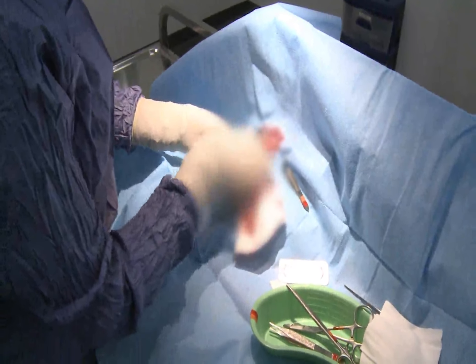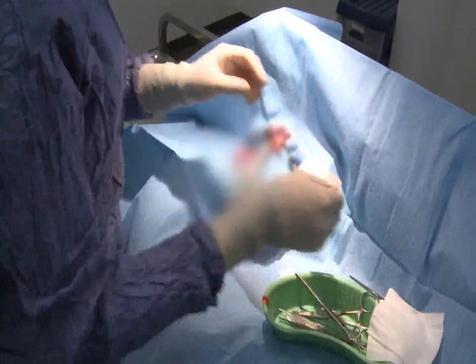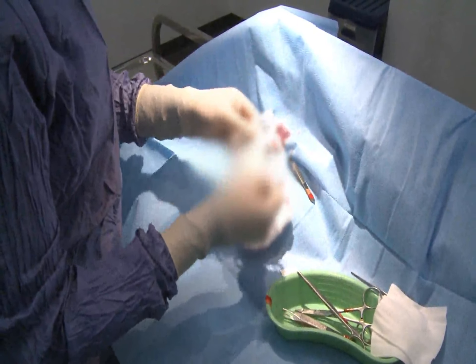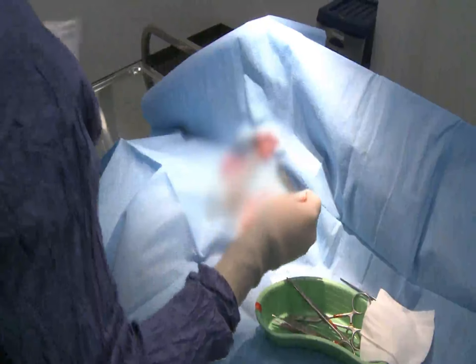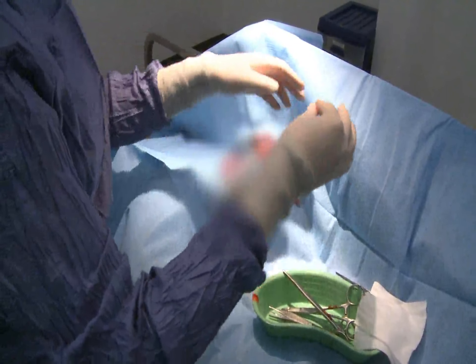I've got my three clamps in place. I'm now going to use my suture material. This particular stuff is absorbable material, so we don't need to take any of these stitches out — luckily, they're right inside the dog. We're tying off the blood vessels so that we can take the testicle away and we know that the bit left inside the dog isn't going to bleed.